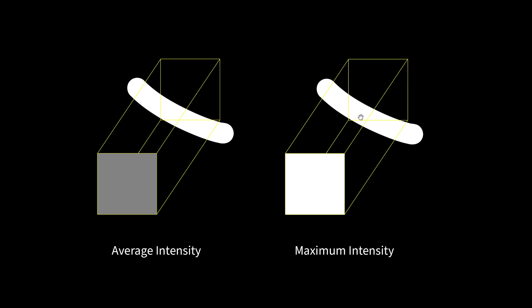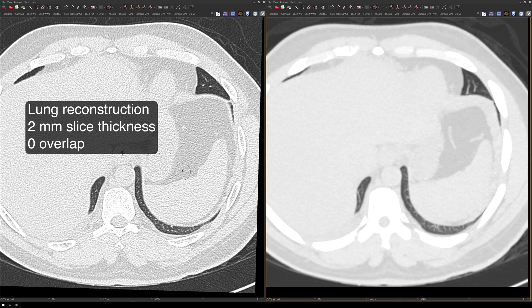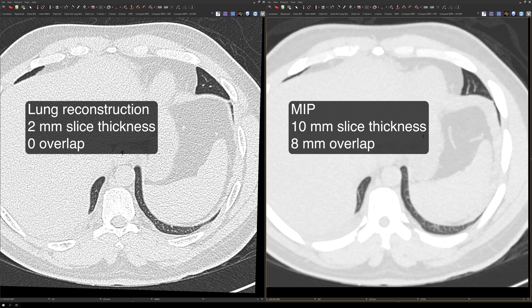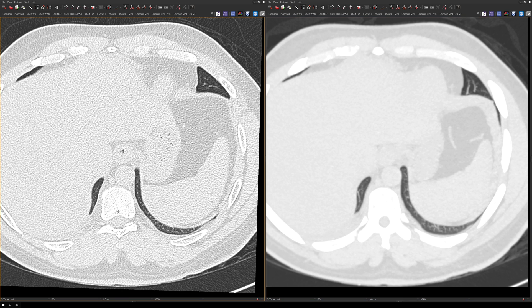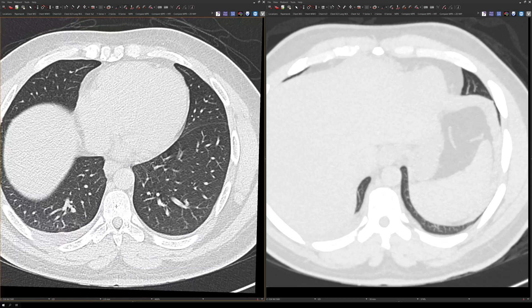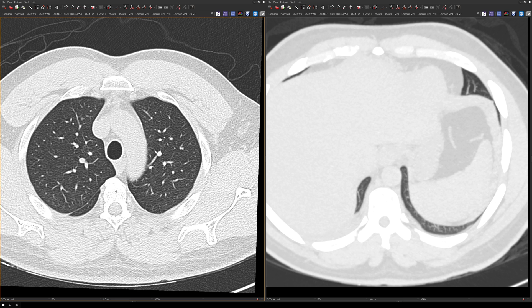Now let's take a look at a real life example. This is a CT of the chest and I have two series up. The series on the left is a regular lung reconstruction with 2mm slice thickness and no overlap. The series on the right are the MIP images with a 10mm slice thickness and an interval of 2mm, which means each slice moves 2mm, so there's 8mm of overlap between two consecutive slices. I'm going to demonstrate the primary purpose of MIPs in lung imaging — looking for lung nodules. I'll scroll through the regular lung recons first; look for nodules in the left lower lobe. Now I'm going to scroll through the MIP images — look for lung nodules in the left lower lobe.